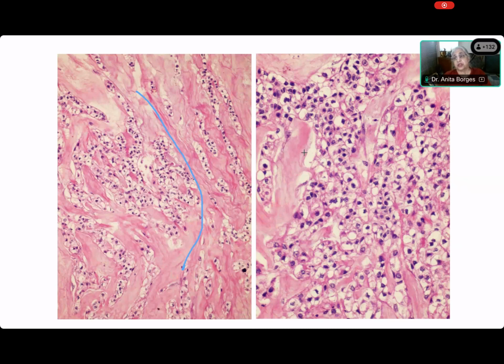What do you want to say about the nuclei, Somik? Nothing. No, eccentric nucleus. Huh? No, eccentric nucleus. Eccentric. Why are they eccentric? What is eccentric about them? Anvesha also saw them as eccentric. I don't see them as eccentric.